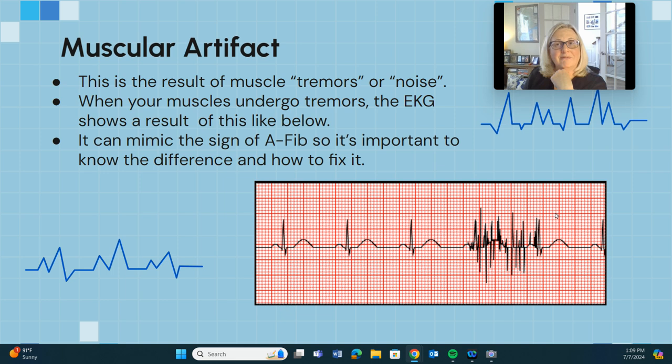For me, I would make sure, number one, that the patient is trying to lay still. If they do have a condition like Parkinson's, I would make sure that it's not on their shaky hands. Put it on their wrist? I would take it off the wrist, put it up to the shoulders. If they can't seem to keep their foot straight, they flex their feet, point, flex, wiggle their toes. Yes, even wiggling your toes can cause this. Move it off their feet, get it up to their thighs or up to their belly.